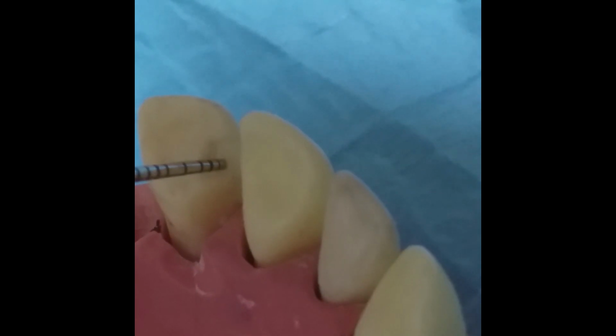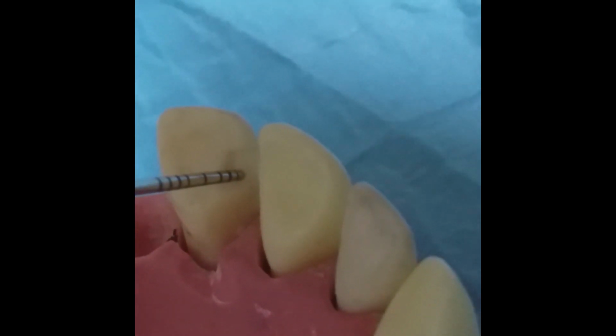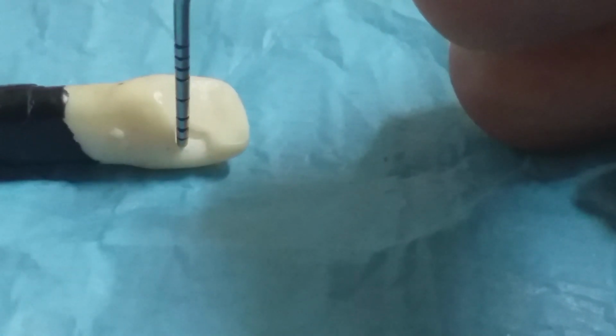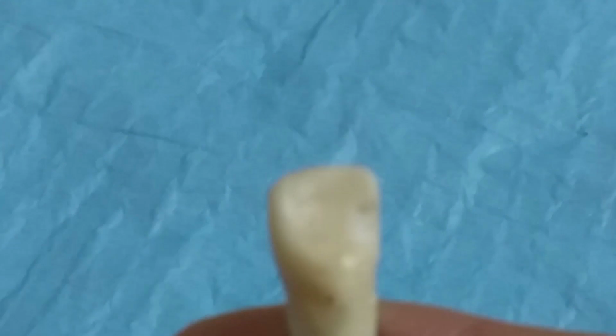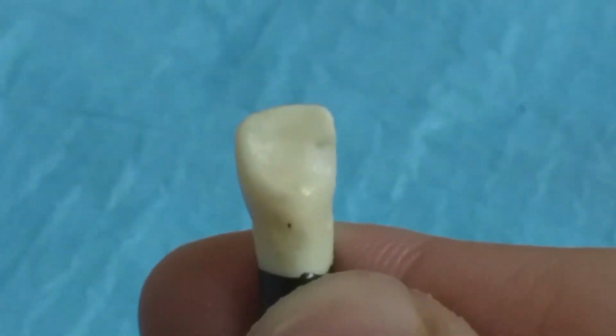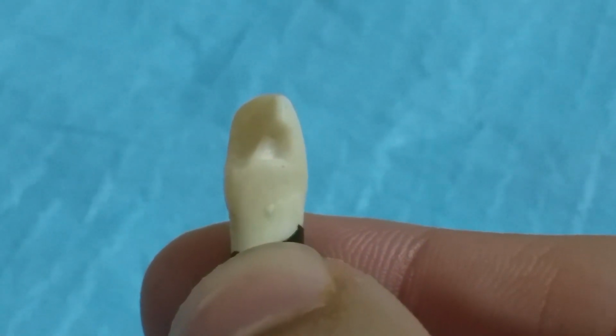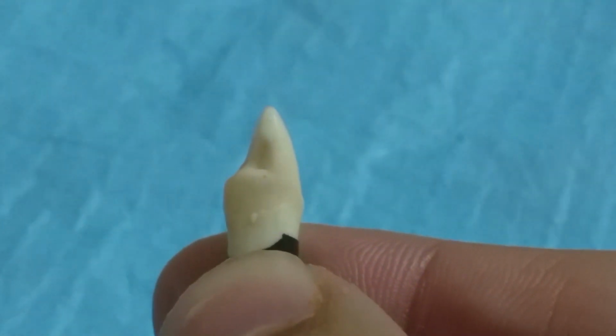Now using a probe to determine the depth, it's, as you see, 2 milli in facial depth. Another look, we have finished the lingual side, and also from the proximal.